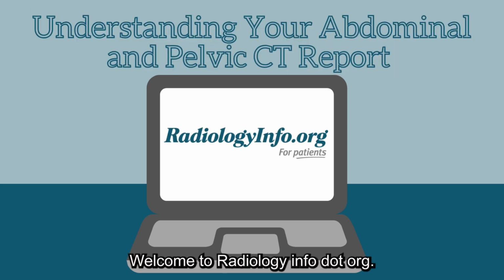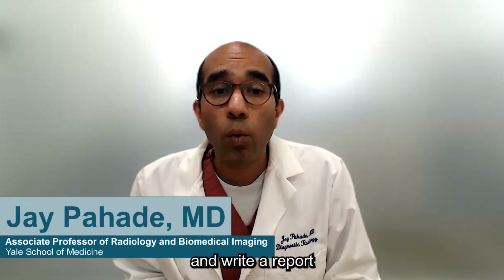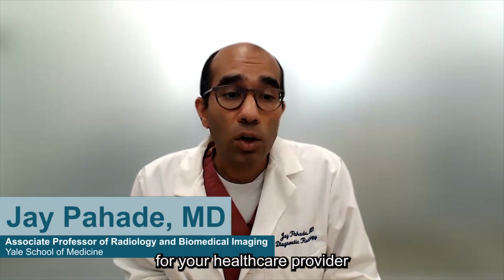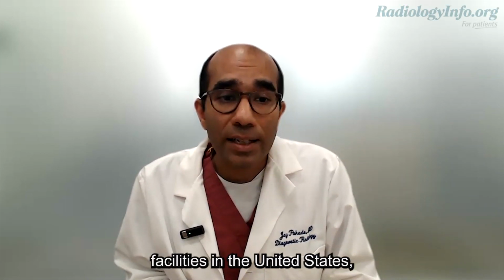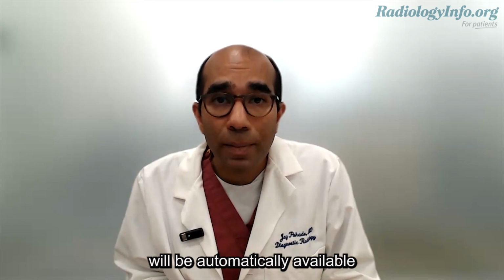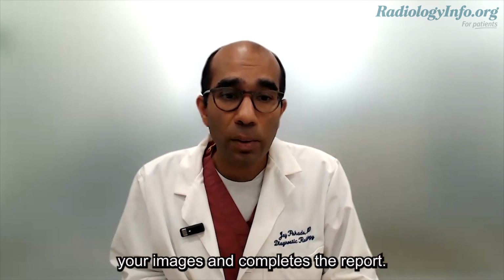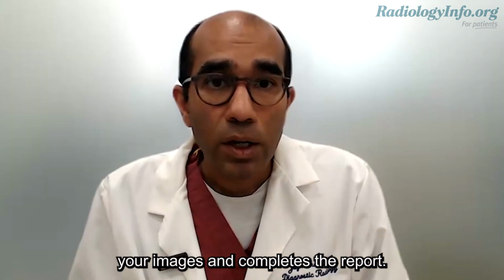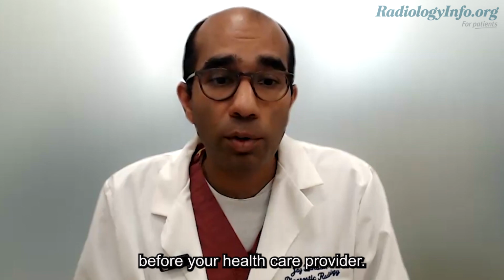Welcome to RadiologyInfo.org. Your radiologist will analyze your images and write a report for your healthcare provider, who will then discuss the results with you. At most healthcare facilities in the United States, your radiology report will be automatically available in your patient portal after the radiologist reviews your images and completes their report. So you may actually be seeing the report before your healthcare provider.